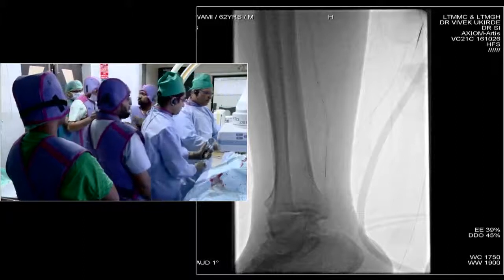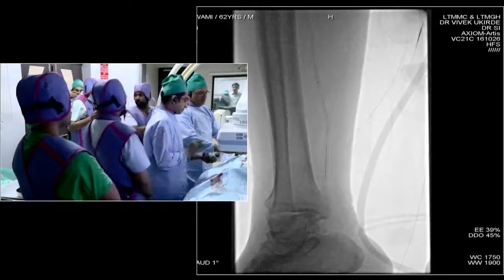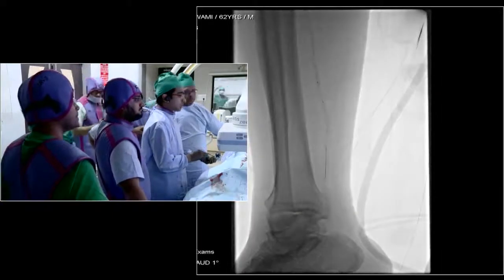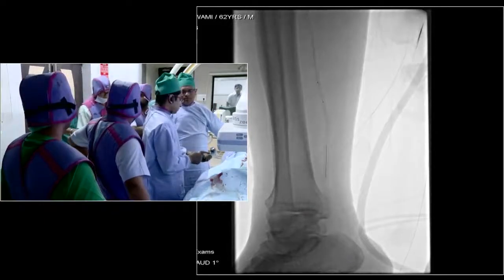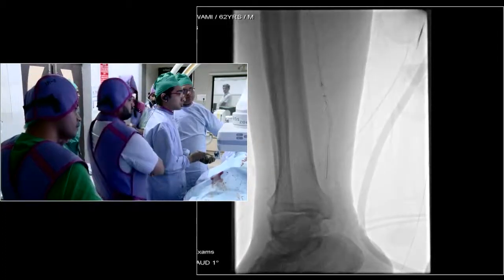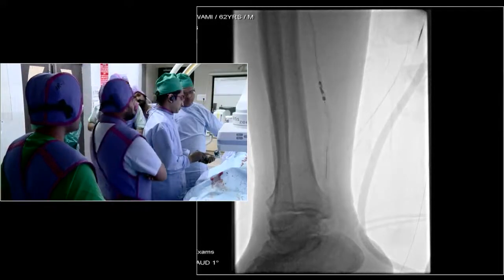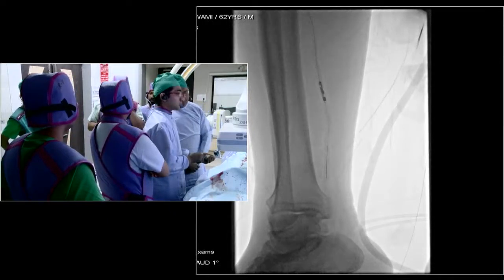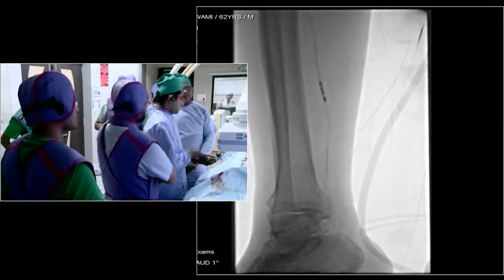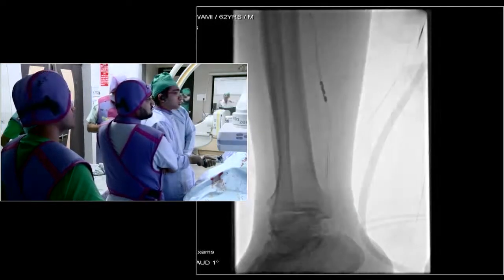When you do pre-dilatation, you must go to higher pressures, or even take a slightly bigger balloon for pre-dilatation, because that will be better preparation. Now, regarding the bioresorbable scaffold characteristics — are they the same as Meris 100 or something different? The characteristics are more or less similar especially for BTK lesions: same strut diameter, same drug volume, and the drug is also sirolimus.